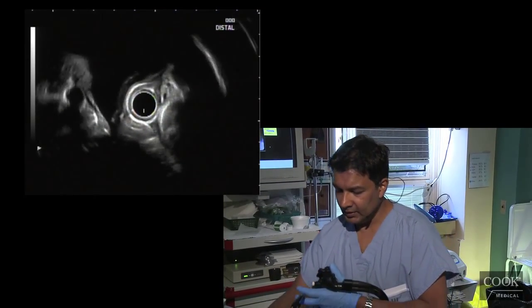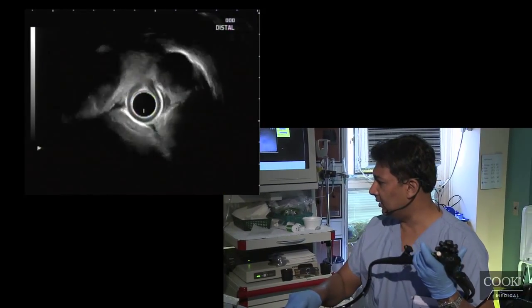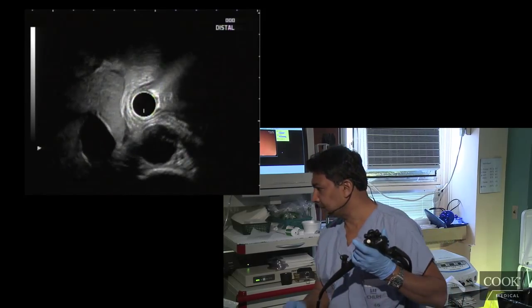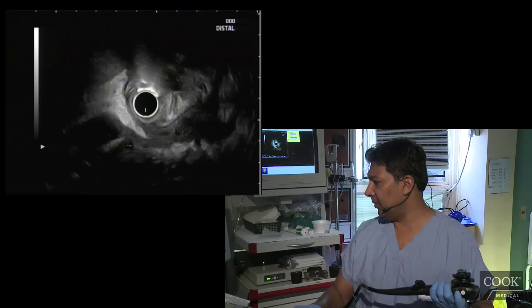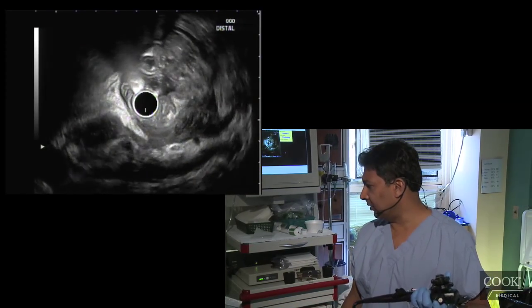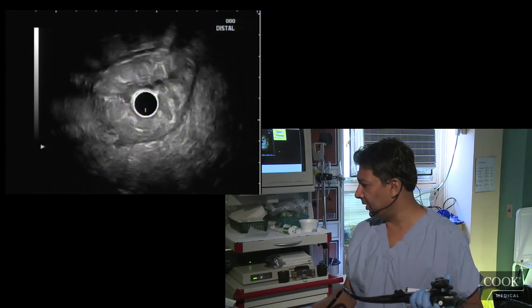She's going to be a little bit difficult to sedate, I think, because of the ETOH. As a general rule, you shouldn't be doing radial — you should really be doing linear. We're only doing this with the radial because we ran out of scopes; we sent a scope out for repair.